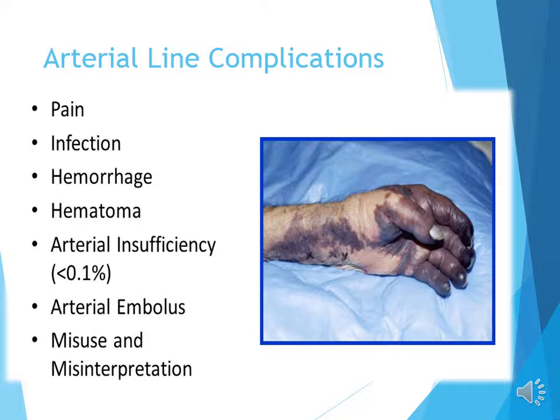Arterial line complications, so pain. It can be painful for the patient. If they are complaining of pain, please go and assess that site. Make sure that it's still flushing okay and that your site looks all right.